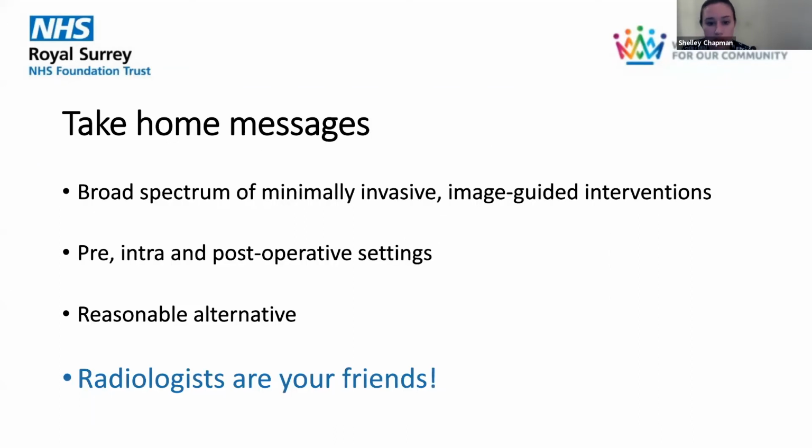So take-home messages are that we do a broad spectrum of minimally invasive image-guided procedures. We have a role in the pre, intra, and post-operative settings. Sometimes we're a reasonable alternative, so please consider us. And remember that radiologists are your friends.